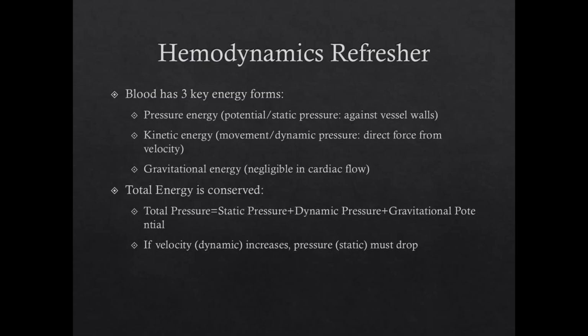Kinetic energy is movement or the dynamic pressure, and it's the direct force from the velocity of the blood, so the pressure forward. And total energy is conserved, so total energy or total pressure equals static pressure plus dynamic pressure plus the gravitational potential, which we said was negligible. So if velocity or the dynamic pressure increases, pressure or the static pressure must drop.